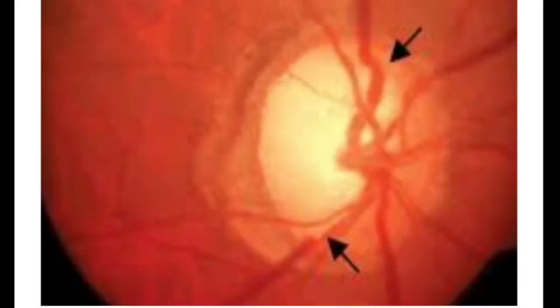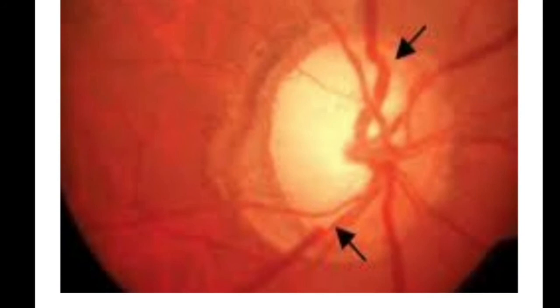Okay, next important sign is the Bayonetting sign. Normally this vessel would have come over the neuroretinal rim like this, but since there is deep cupping here, this vessel will bend along the depth of the cup. So when you examine the patient with a slit lamp, you may just appreciate the course of the vessel and then the course which is just coming over the neuroretinal rim. You will miss this part. It looks as if it is broken. This is called the Bayonetting.